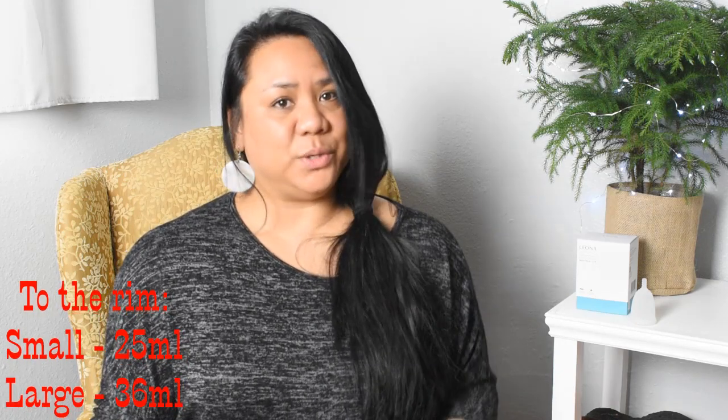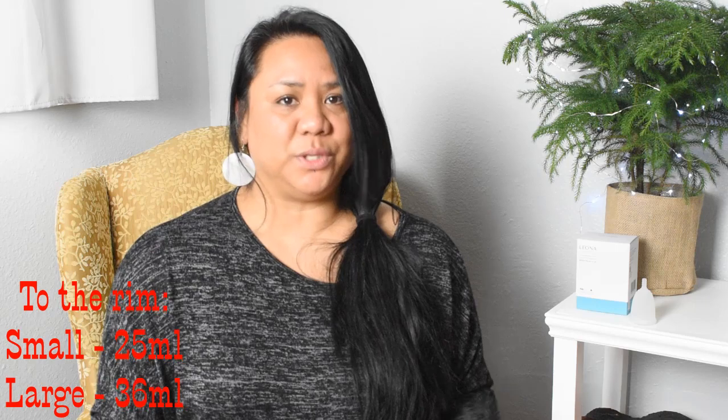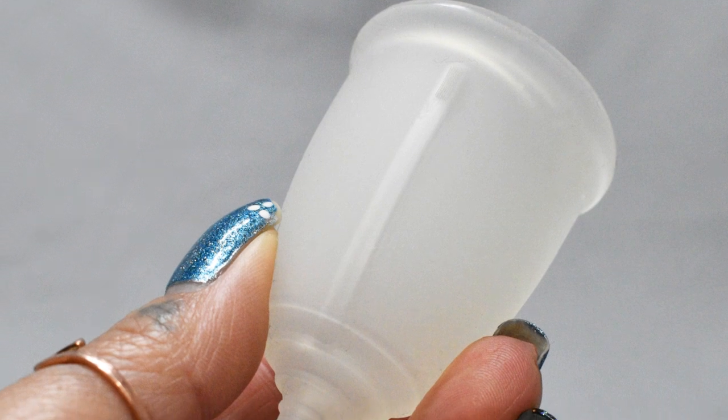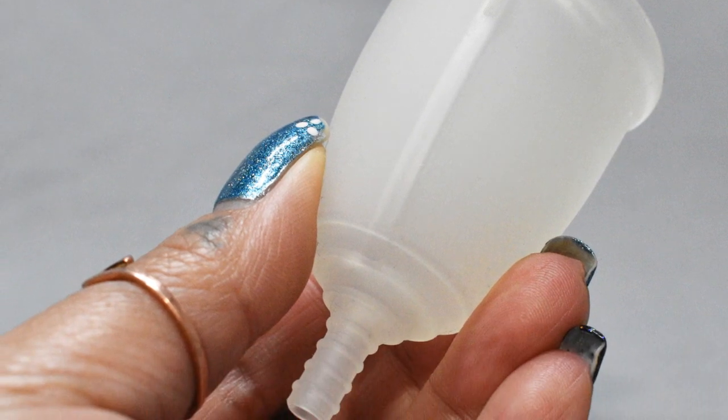My period was never really super heavy the times that I wore the Leona cup, so I can't really tell you how the capacity is. When I did use the Leona cup I was able to empty it in the morning and then once at night before I went to bed. Throughout the day I was comfortable. I didn't experience any burping from the micro air holes, the channel, or the valve. And again, if I would have trimmed the stem I probably would have been a little bit more comfortable than I already was.